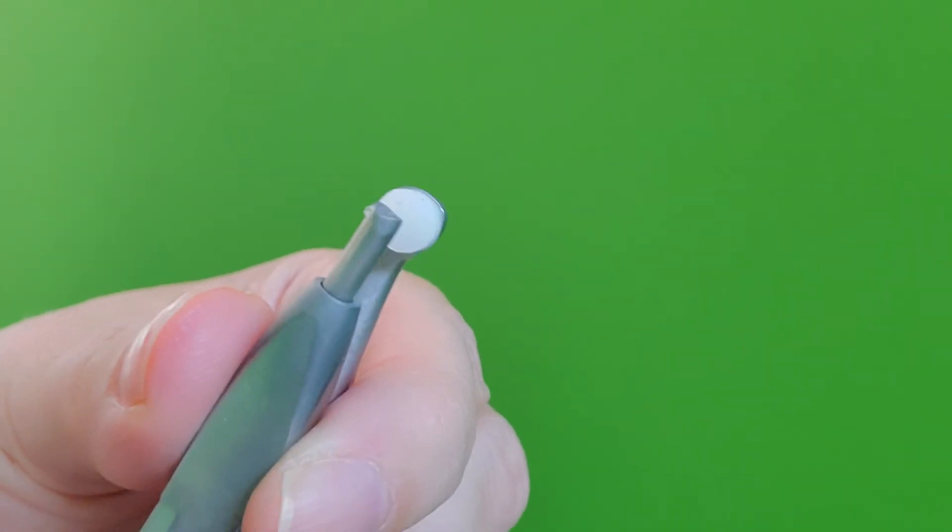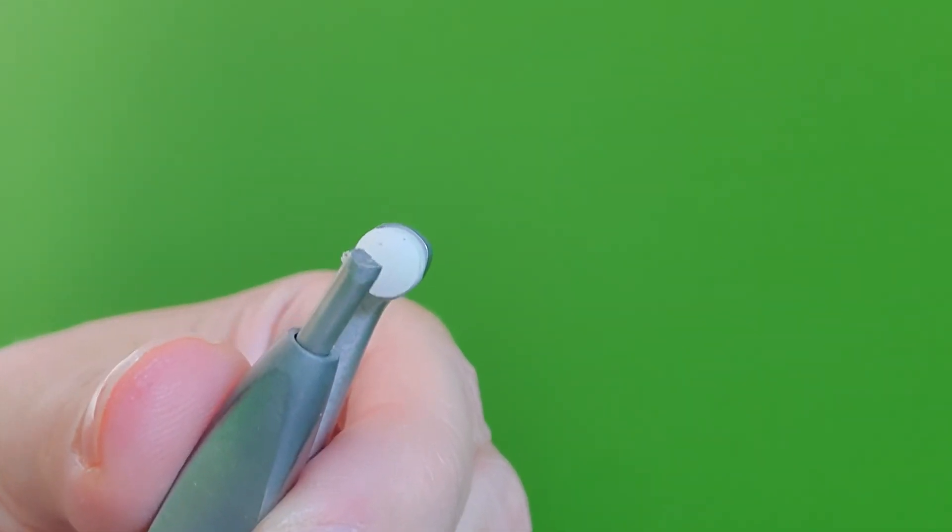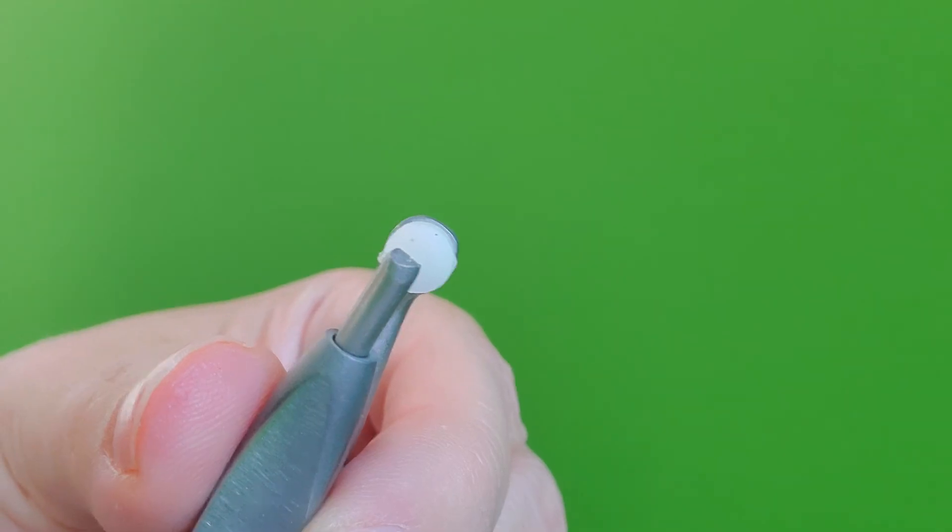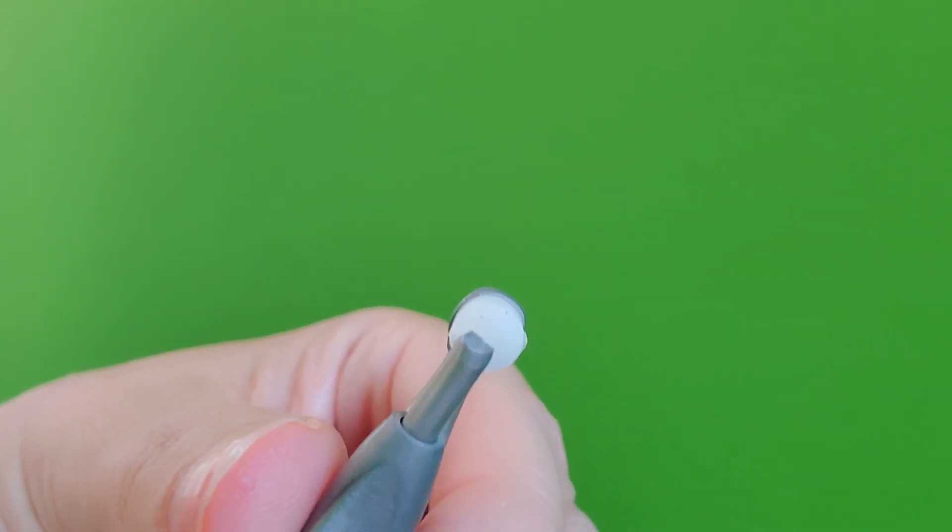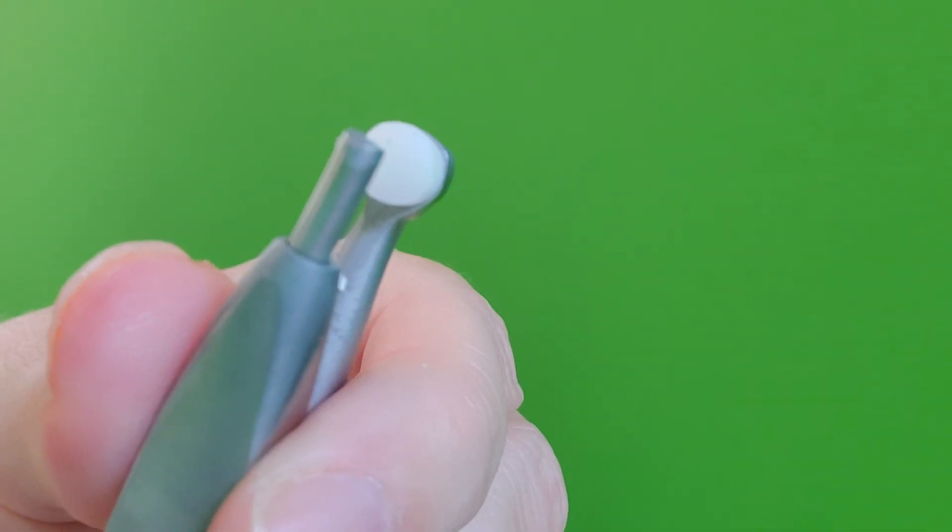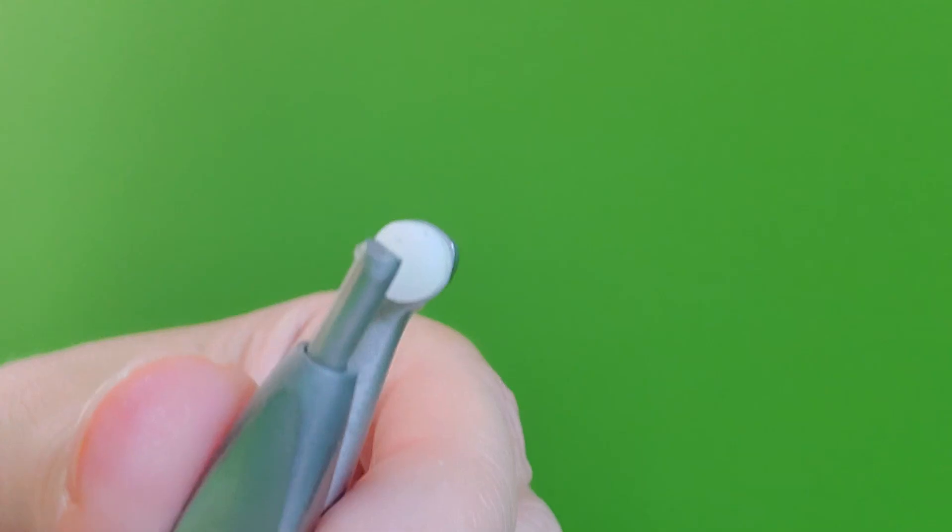And you can just replace the tips. So I would buy multiple tips, because these things will wear down. Theoretically, you could probably sharpen it if you were savvy with a burr or a disc or something.